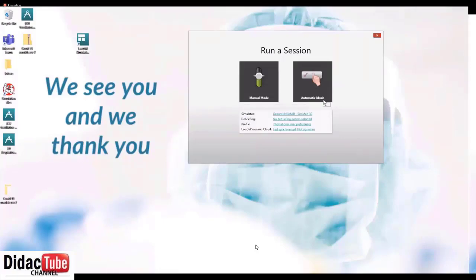These scenarios are completely unlocked. So if at any stage there's things that don't feel right or things that you would like to change to suit your local practice, that is totally okay. We've set them up in a scenario file that is unlocked for you to make further changes later. Okay, let's keep going.